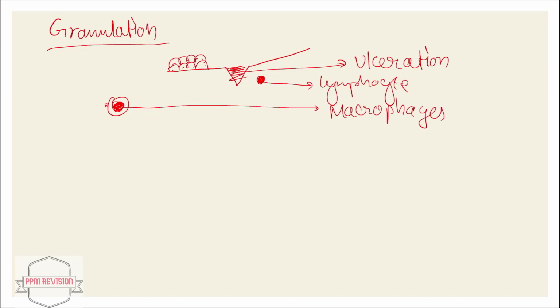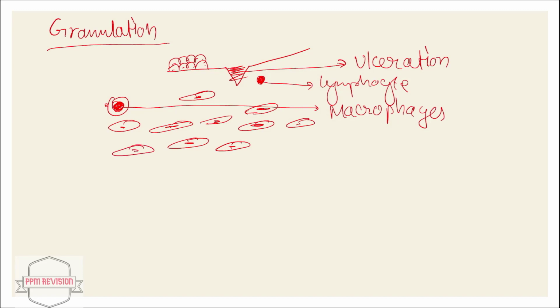Macrophages are also found. Moving ahead, we'll also find the fibroblast. A series of fibroblasts can also be present. So in case of a picture-based question, you might be asked about any particular findings in the diagram and you should be able to recollect. For example, in case of Hashimoto thyroiditis, there's presence of Hurthle cells. So the question can be framed in that manner, like, which of the following has Hurthle cells? These are basics and we cannot make mistakes in them.